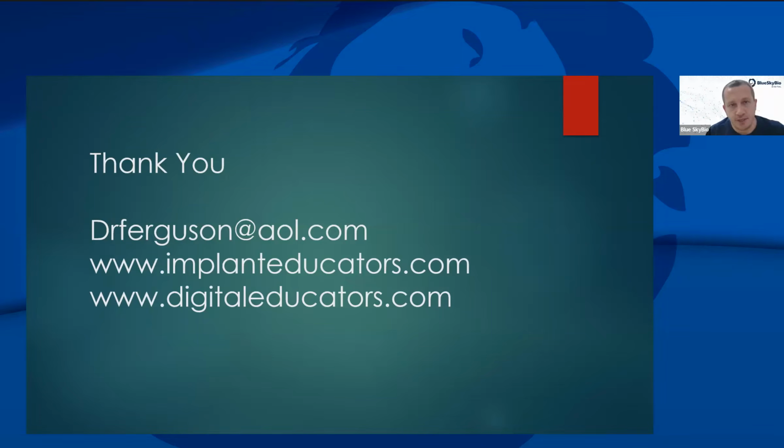Okay, great. Yeah, if anybody has any questions, I think we have time for a few questions. You could just enter into the Q&A chat box that's on your screen. Rick, there's discussions on different groups about the face scans being done with cell phones and cell phone apps. Have you had any experience with that?